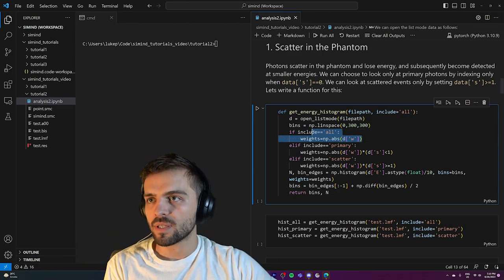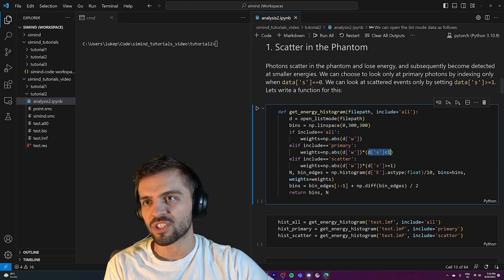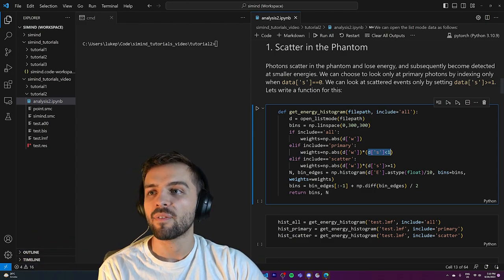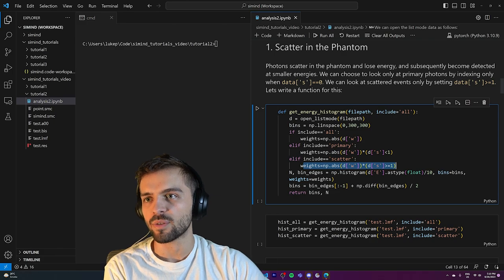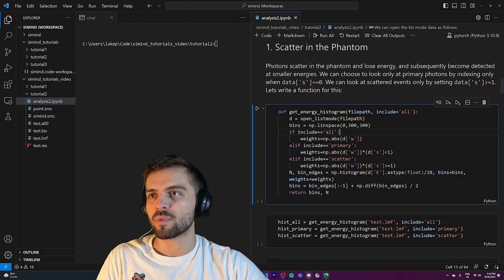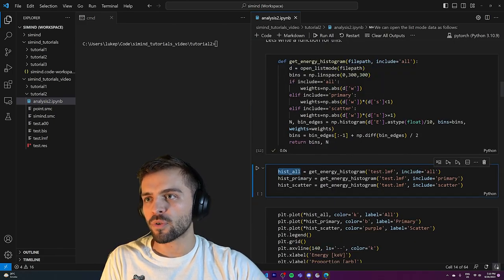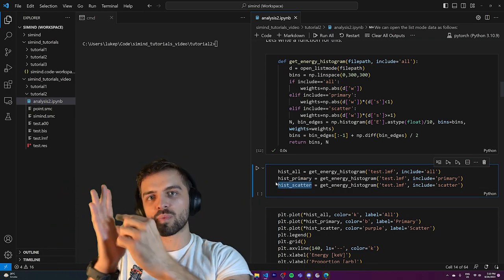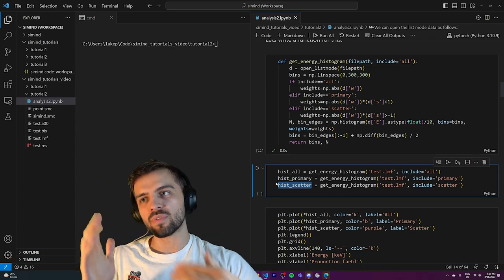If I want all the weights, I go like this. If I only want primary weights, I look for scatter order less than one — basically zero, it hasn't scattered at all. If I want scattered events, I weight them accordingly. From that I can get my histogram of all photons, primary photons, and scattered photons. Remember: primary photons go right into the detector; scattered ones get scattered and then move into the detector.